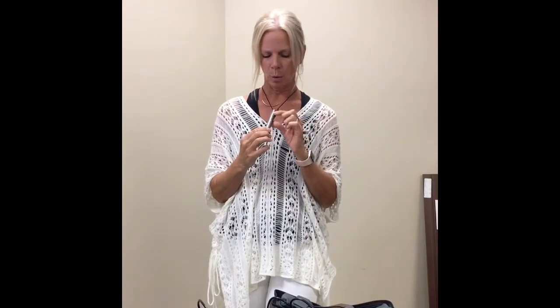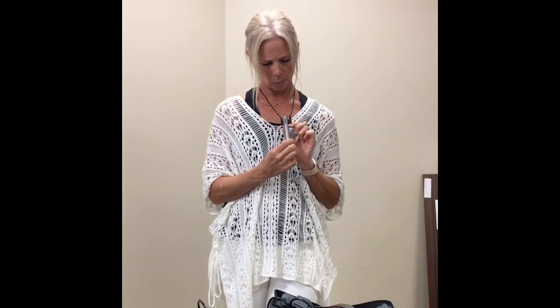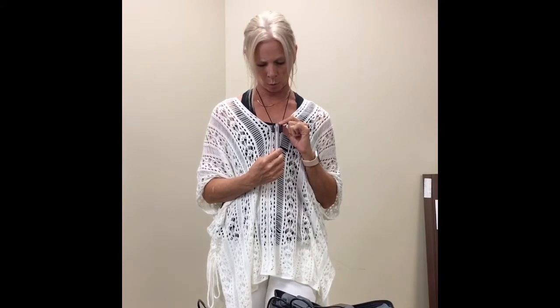So when you're not talking or you're having a conversation with another student or another teacher, and the student with the hearing loss doesn't need to hear exactly what you're saying, you will press one time the power button. When I press the power button, the color changes to purple. That means it is in the mute mode.